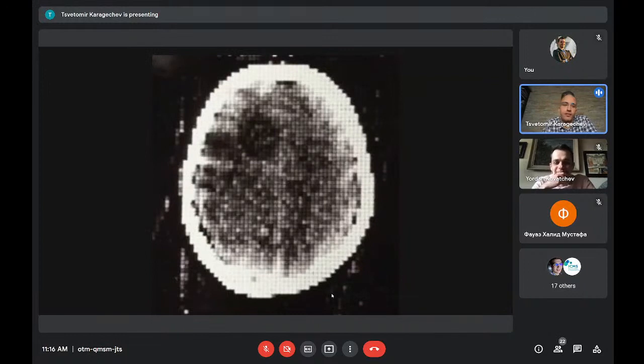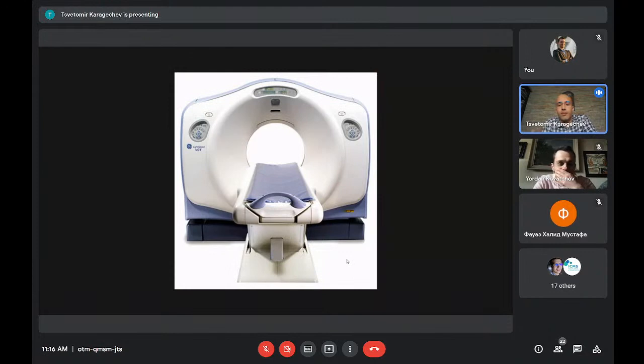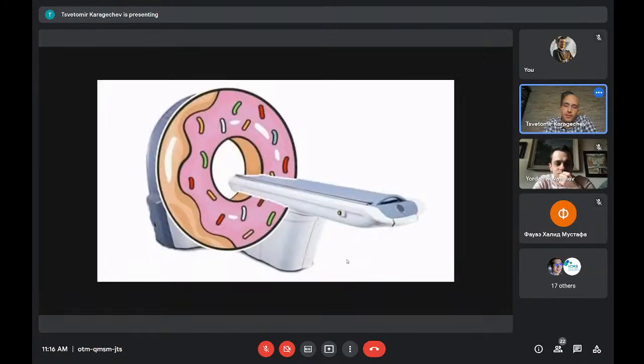And this is actually the first image of a living patient. The reconstruction of the images took a whole night, but in the end, a recognizable image of a brain tumor was produced, and even Hounsfield himself was amazed by the result. After that, the life of every radiologist, every physician, and every patient all around the world was never the same again. So this is how a modern CT scanner looks today. And if you're following basically any Facebook or Instagram page with medical memes, I think you're familiar with the CT scan.